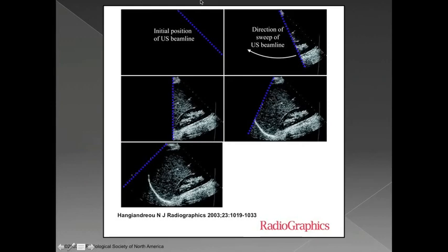So how does the ultrasound machine actually take all of these beams and echoes and turn them into an image? Well, essentially what the ultrasound machine does is it scans across the field of view with numerous different ultrasound beams and takes the echogenicity pattern, or the reflection pattern, from those and stitches them together into one cohesive image over the field of view. Initially the machine sends out a beam along the blue line, and then the next one next to it, and the next one, until you've built the whole field of view by sweeping across with different sets of echoes.